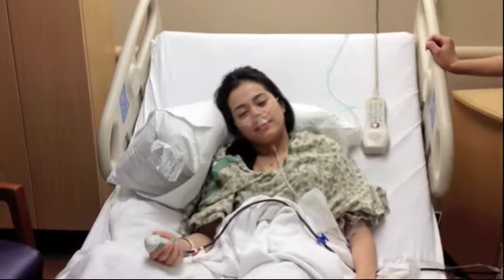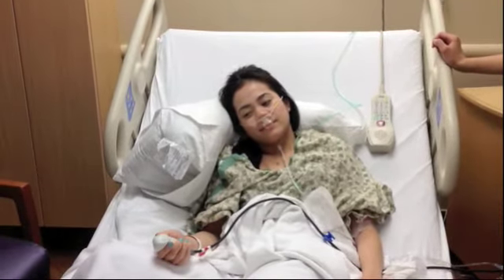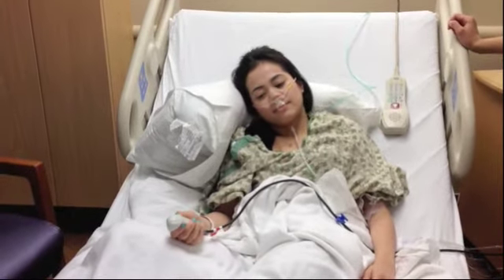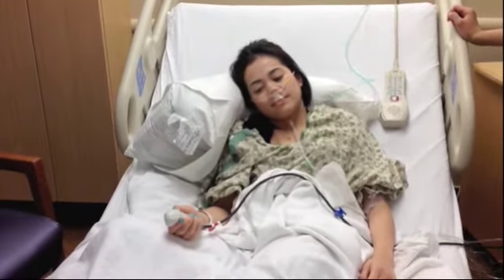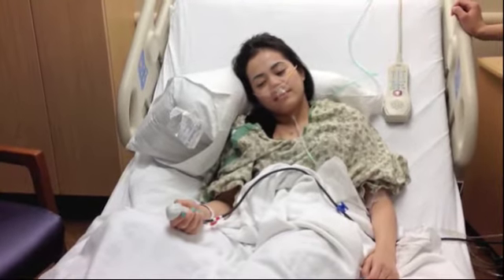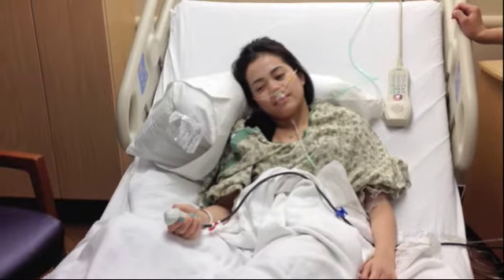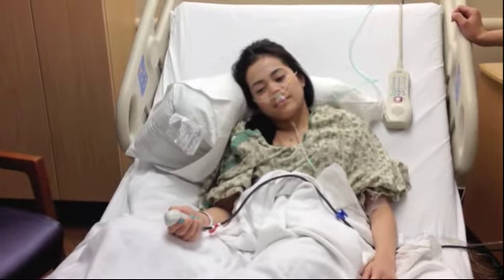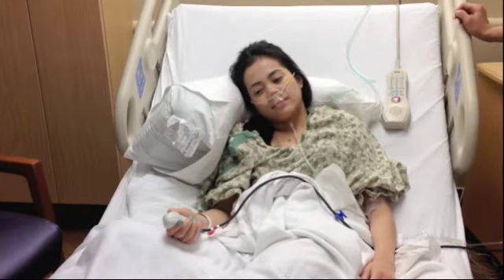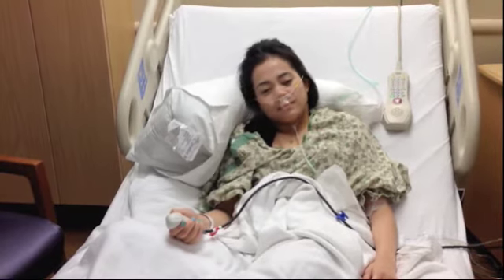Once the bolus dose has been delivered, a preset amount of time must pass before another dose can be requested. This is known as the lockout period interval. The purpose of this time period is to allow time for the opioid to work. Although the lockout period does limit the amount of analgesia the patient can request, it should not be seen as a method of preventing overdose, as many nurses incorrectly assume.